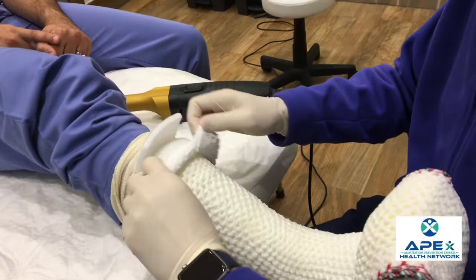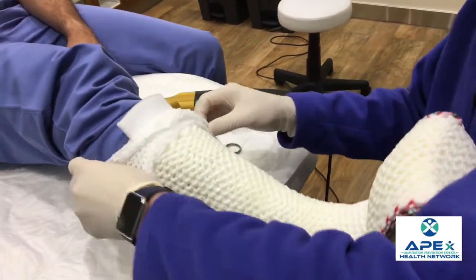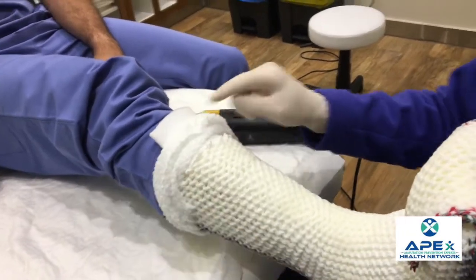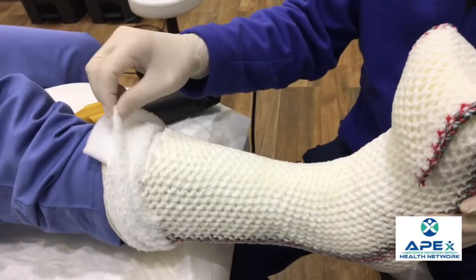We'll remove this area where it was attached to the cast. Because this only vibrates, it's not going to go through anything soft, so the cast saw will not cut through any of this padding.